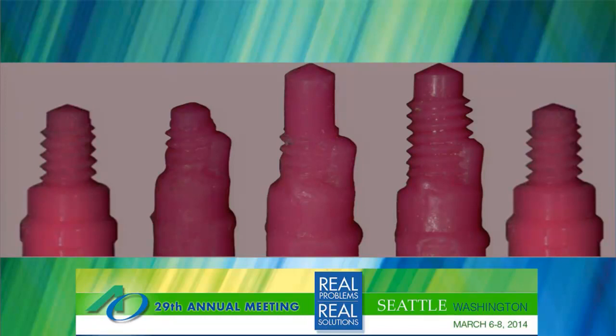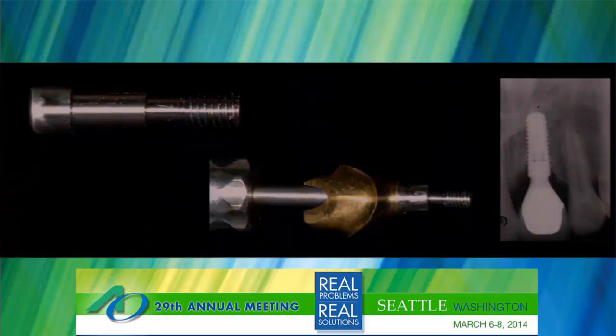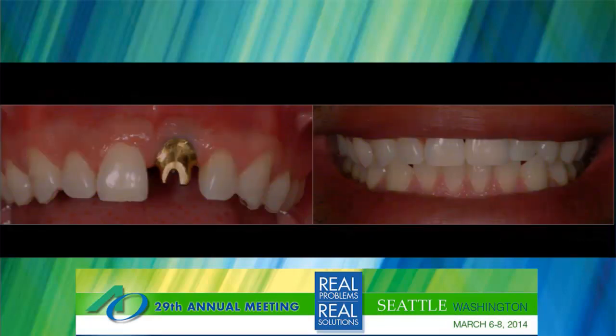However, in this particular case, there was not a prosthetic option because there are no parts. So we had to create the parts to re-restore it. Before, he was going to get a zirconia abutment, and that's really not possible at this point because the through bore on the abutment has to be just a little bit larger to accommodate the larger screw. So I went to a gold hue titanium abutment, and then of course there's the matter of procuring the screw. Since there is not one out there, we just made one. The screw is a 1.8 custom made for this situation, and the abutment is delivered to prescribed torque, and he's re-restored. So the question is, when you see this whole case, what went wrong?